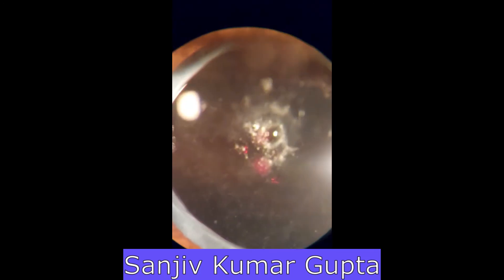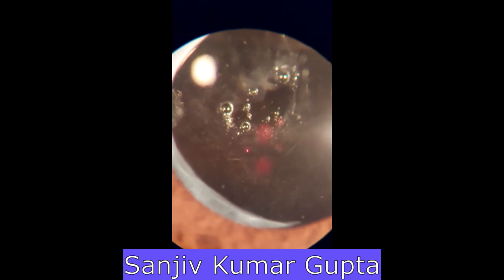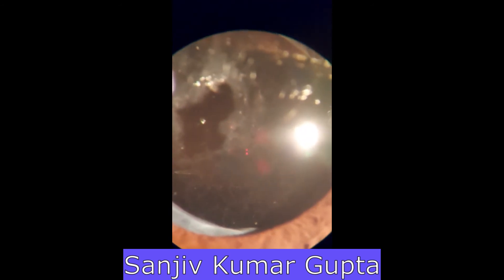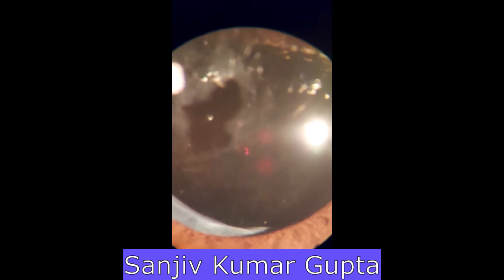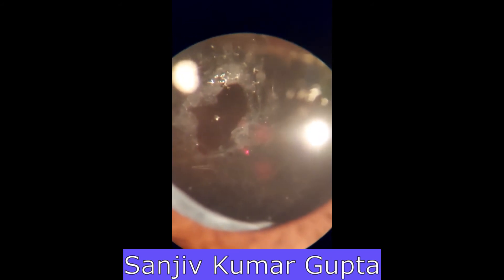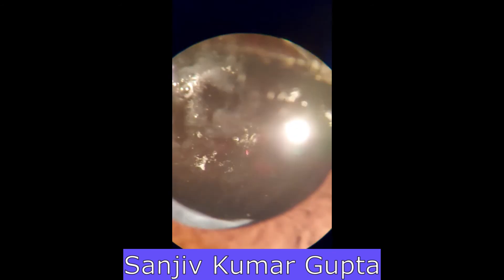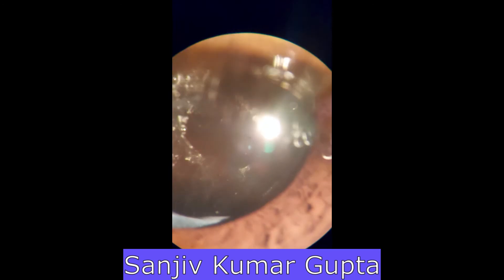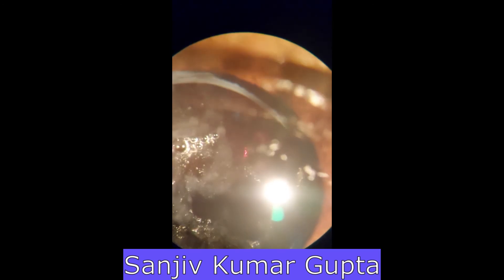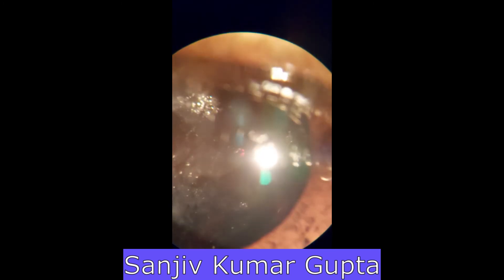This video has been captured using a mobile phone camera because these YAG laser machines are not equipped with any facility to attach a camera. Here we can see an aiming beam with two separate points of red neon laser, which when converging at a point, that is the point which decides where the laser is going to cause explosion.